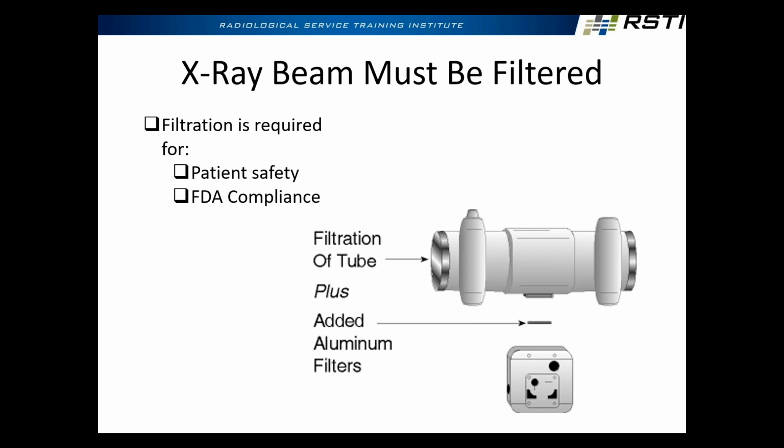And what if we don't want to see the bone? If we don't want to see the bone, then we have to use something else that has a Z higher than bone. Copper. Copper is 29, I think, on the periodic table. Somebody can Google it, correct me if I'm wrong. Should be right around 29. Yeah, copper at 29 has a higher Z than bone, right?